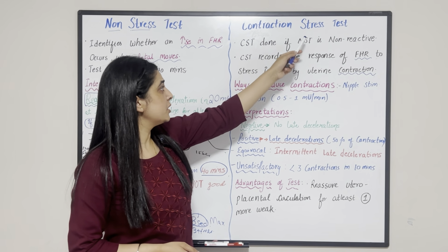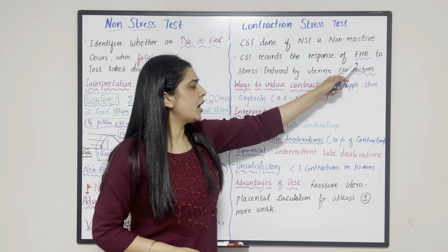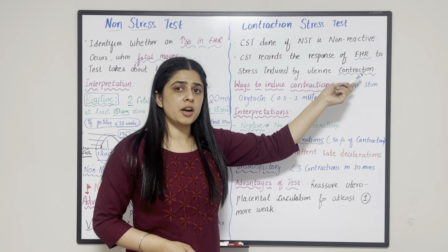test. We do CST. So in CST we observe fetal heart rate in response to contractions. So when we induce contractions, then we assess fetal heart rate.